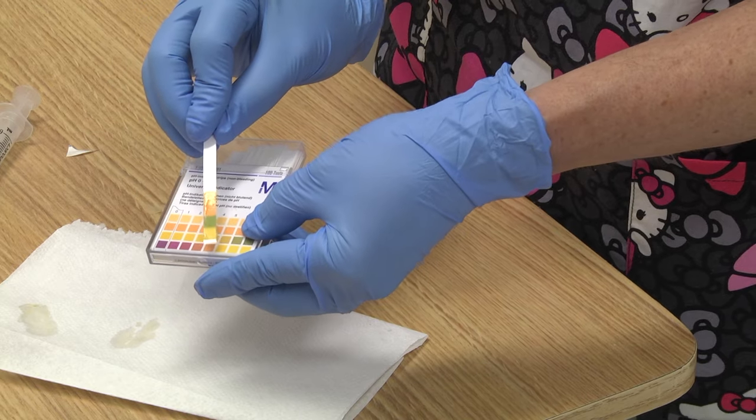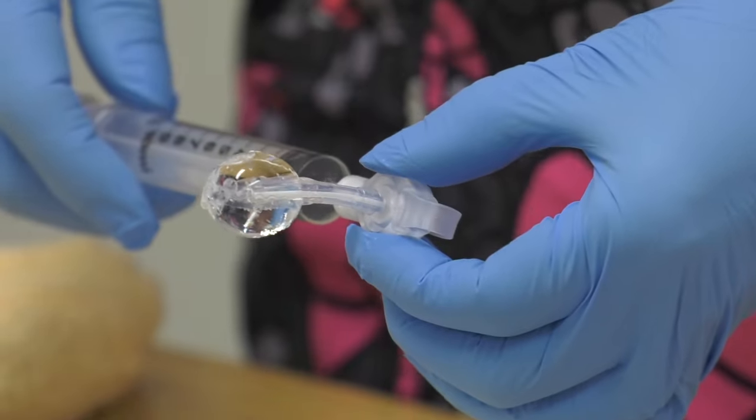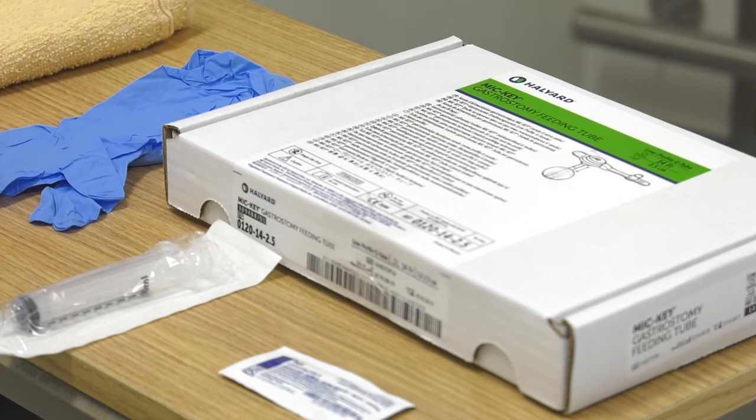Discard the old G-tube. In hospital, a pH test is required to confirm placement, but is not required at home. Mark the date on the box and keep the box. If the Mickey balloon leaks or fails in 30 days or less, please return the broken G-tube to PH NSP.